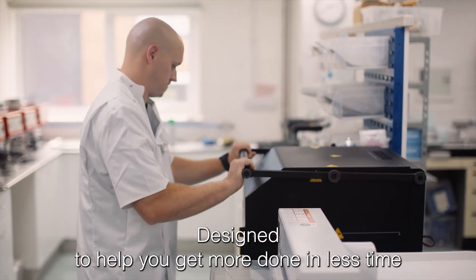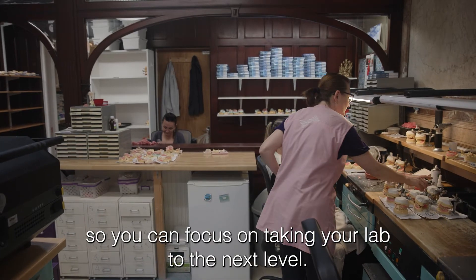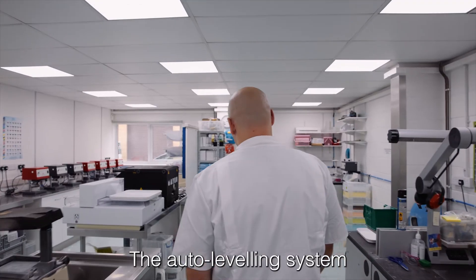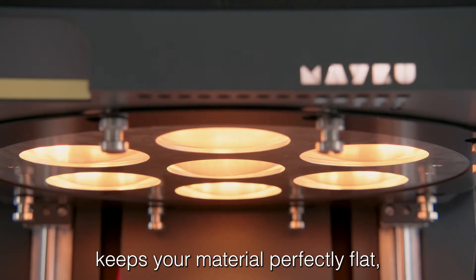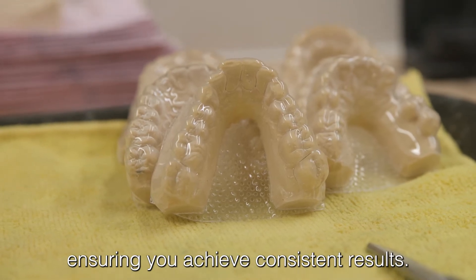Designed to help you get more done in less time so you can focus on taking your lab to the next level. The auto leveling system keeps your material perfectly flat, ensuring you achieve consistent results.